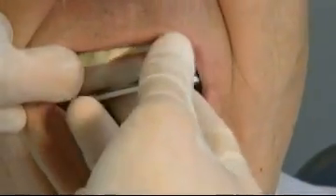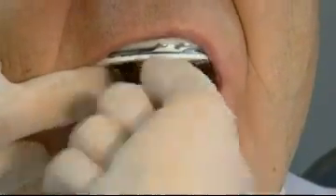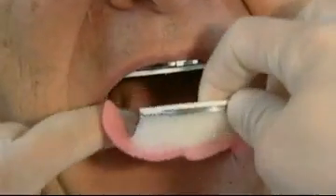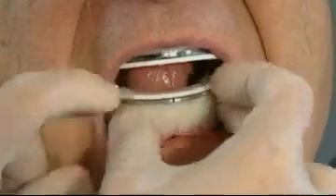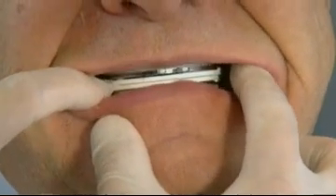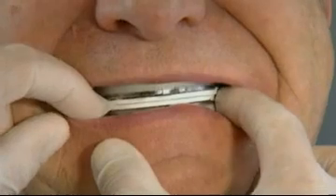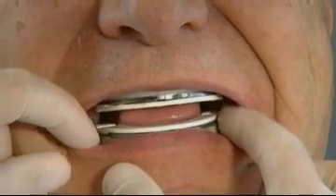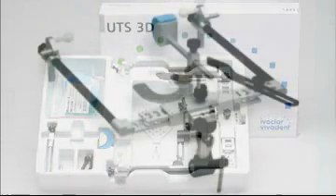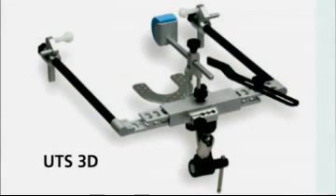Next, take the individual impression using a silicone impression material. During impression taking, the antagonist tray remains in the oral cavity. In this way, the correct relation for the subsequent registration is taken into account. The Universal Transfer Bow System, UTS, has been developed on the basis of scientific principles. The UTS is a recording system that can be adjusted to various reference planes.